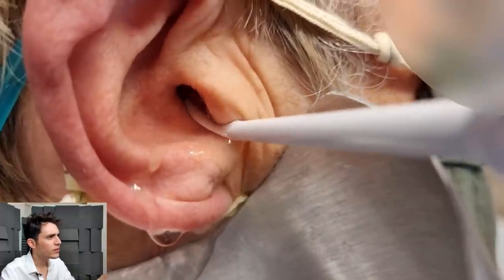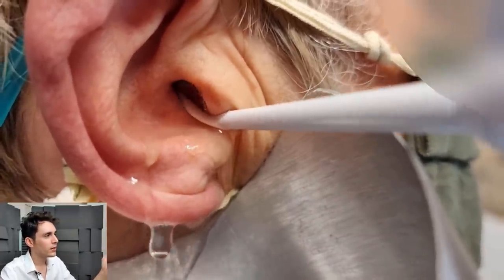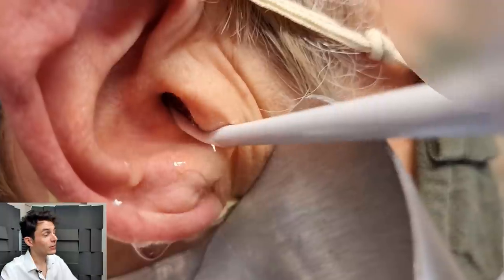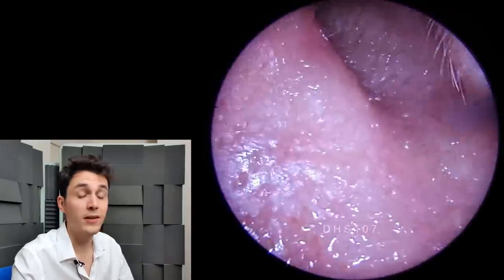Third, you can see I'm kind of moving it around — and there we go, some debris there — moving it like a windshield wiper, kind of at 10 and 2, then moving up and down and so on. That apparently creates vortices in the water and makes swirling patterns, which is more effective at removing the debris.